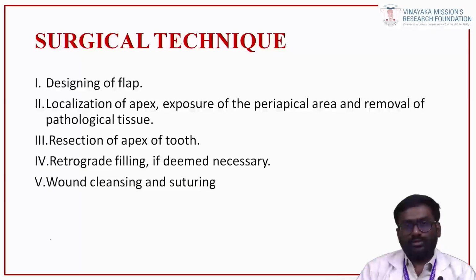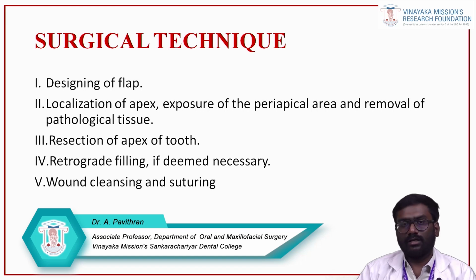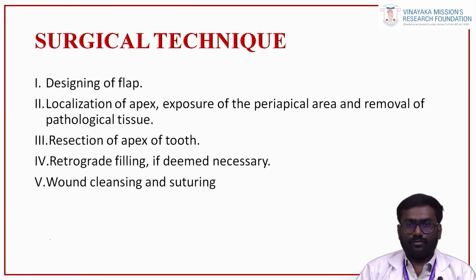Let us go through the steps of the surgical procedure. The first is the design of the flap. There are n number of flaps; we'll see them one by one. After the flap is opened, we have to locate the apex of the tooth, so we have to expose the bone. If there is a bony window, where the lesion has already caused bone resorption, it is easy. You can directly go and locate the periapical region of the tooth. If not, surgically, we have to create a window.